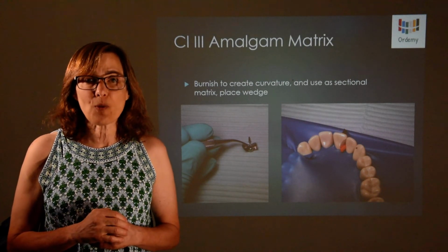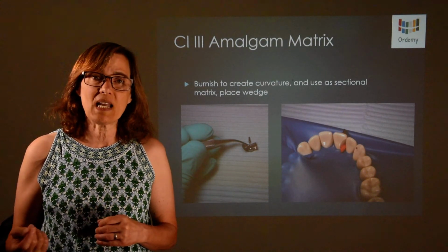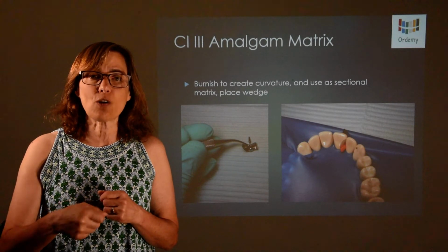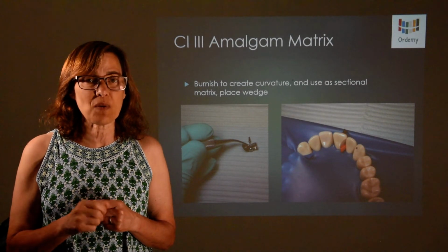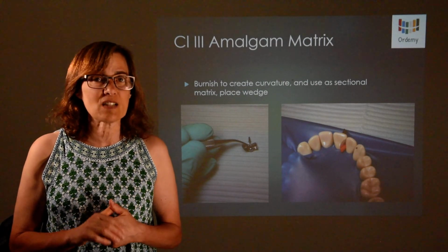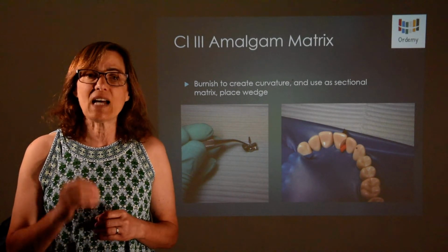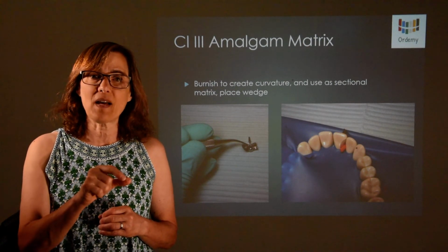At this point, you need to establish the proper contact and the proper occlusion. Therefore, you take your articulating paper and gently ask the patient to bite down. You can even guide the lower jaw to make sure that the patient doesn't bite down too hard and break the restoration if it's slightly high. You will be adjusting with the Tanner carver, the discoid-cleoid, or whatever amalgam carving instruments your dentist may have, and you remove all high spots, especially on the marginal ridge.